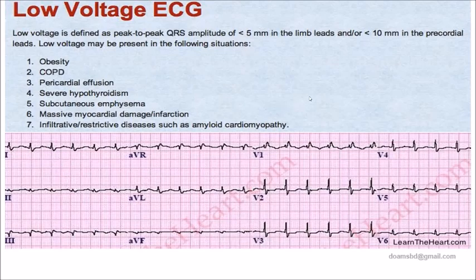But I think there might be some confusion, and I tried to clear it. Sometimes I exchange views with cardiologist colleagues also. The confusion might be about this measurement, from where to where. Look at this. This is the lowest point, right? I'm just moving the cursor in V2. Lowest point, and this is the highest point. So it is called the peak to peak measurement. Peak to peak, not from the baseline.